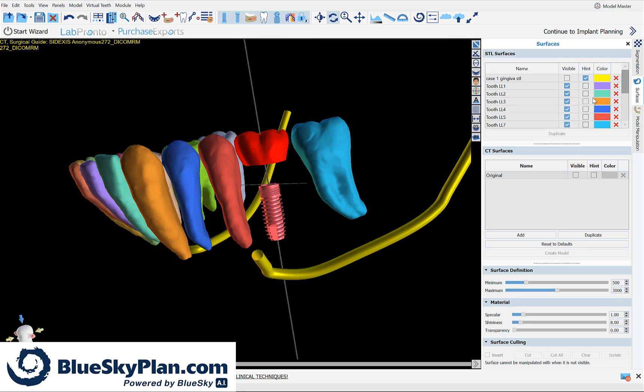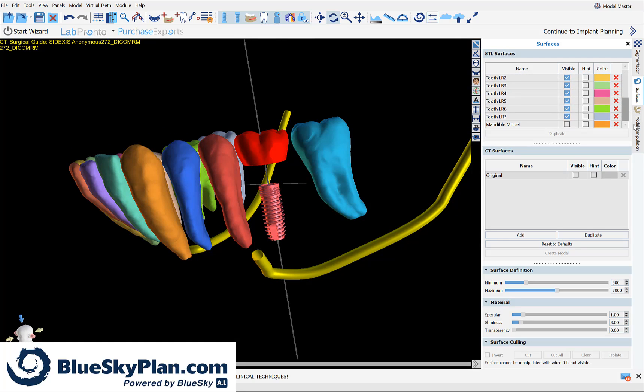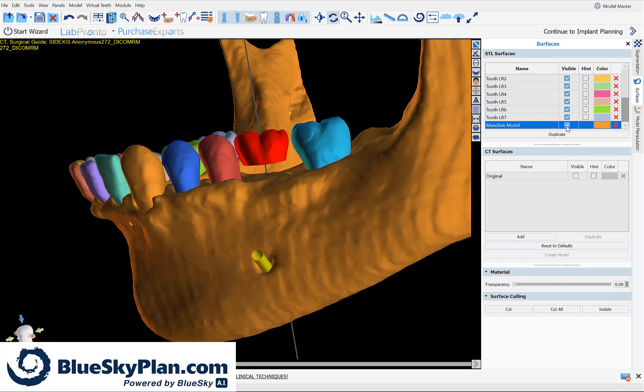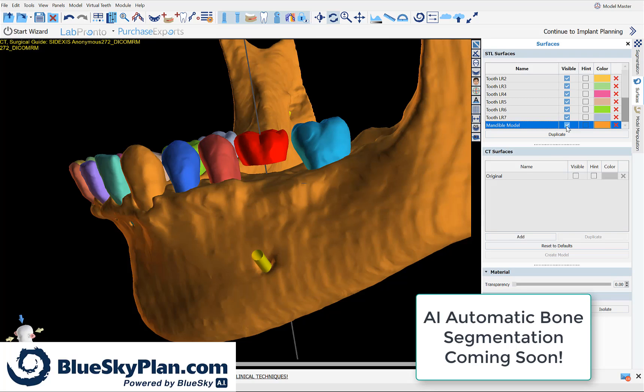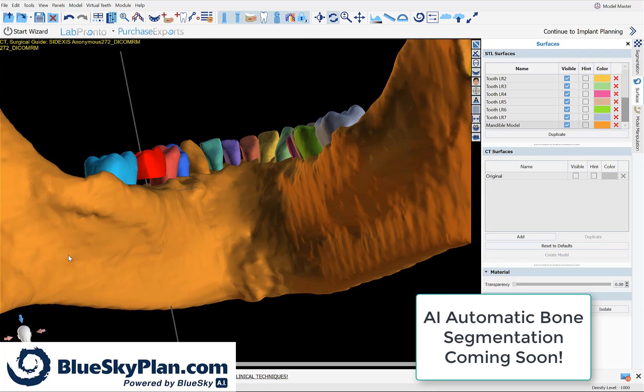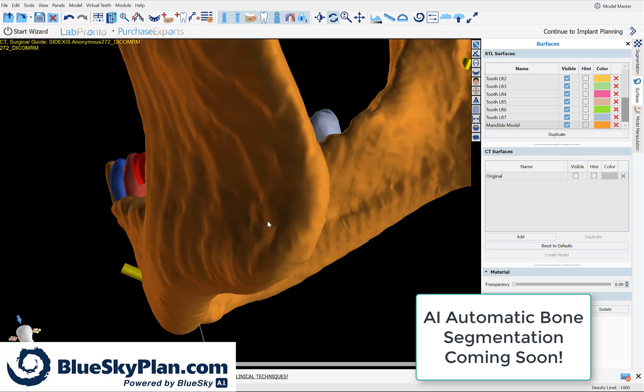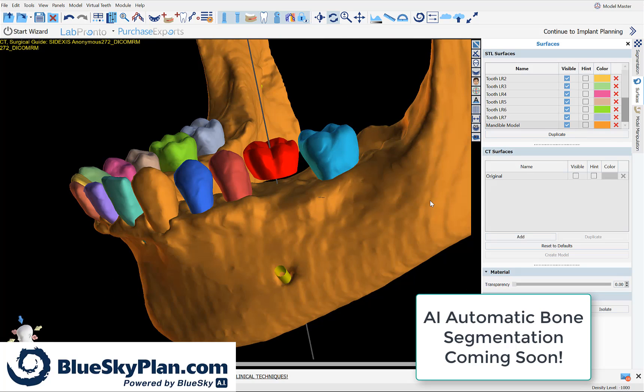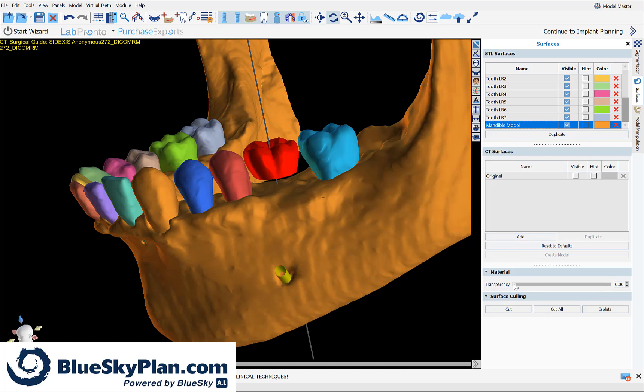And here we're viewing the results of the automatic CT tooth segmentation with the automatically placed implant next to it. In addition, we could turn on our automatically segmented mandible, which is done also with complete automatization, and we can check the accuracy of the implant in the bone by looking at our segmented mandible.